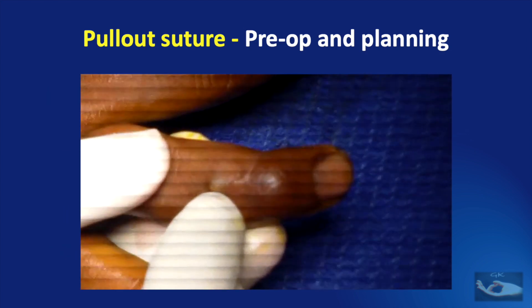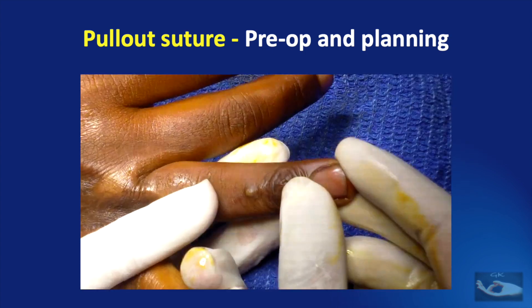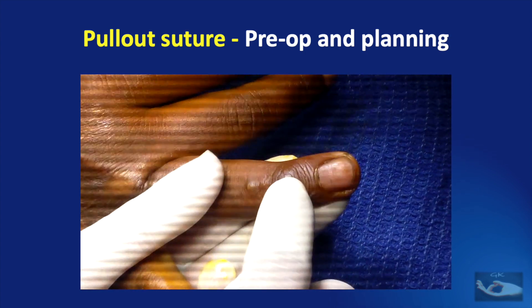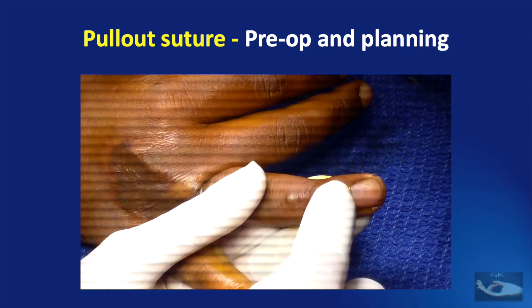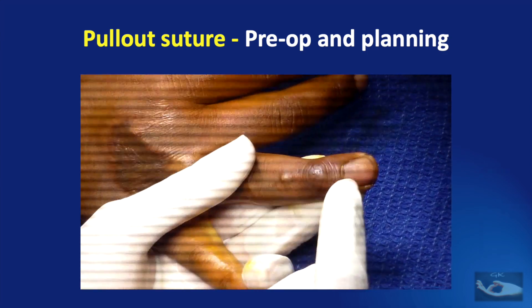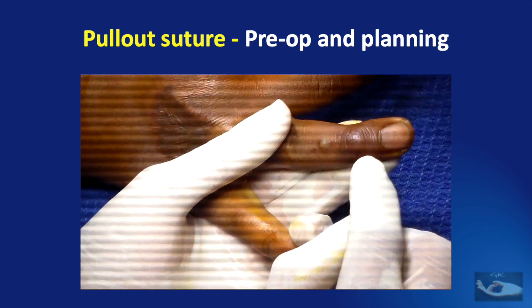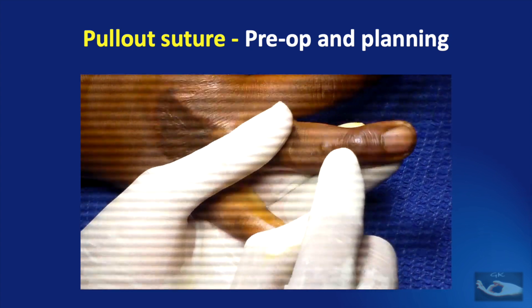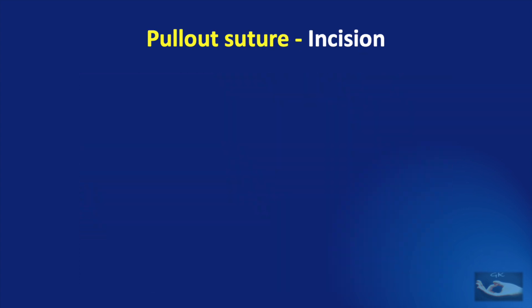There is a small sinus here which I am going to excise. I am going to make an incision over here — first to see what the status of the bone is. Since there is already a scar, I will excise the scar. Usually I would make a cross-finger flap-like incision and raise the flap for good exposure, but here I will extend the existing incision distally and proximally. After giving a supraclavicular block, the right hand was painted and draped and the tourniquet raised.